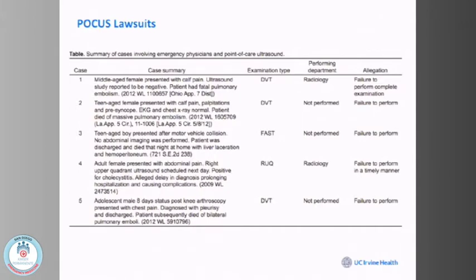But DVT is kind of funny. While I really like the positive predictive value of DVT, when I see it, it's awesome, I made the diagnosis. The negative predictive value of a 2-point DVT exam really needs to be put in the context of your pretest probability or suspicion. If my pretest probability is high, Wells criteria is high, I do my 2-point point-of-care ultrasound, and I don't see a DVT, I'm calling radiology for those studies. It's one of the few times I will get a radiology ultrasound: if my clinical suspicion does not coincide with my bedside ultrasound. Does that make sense?